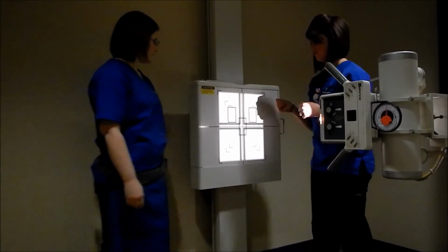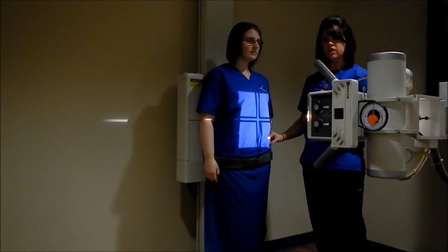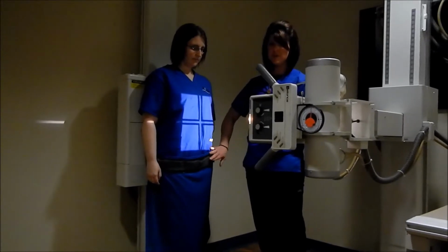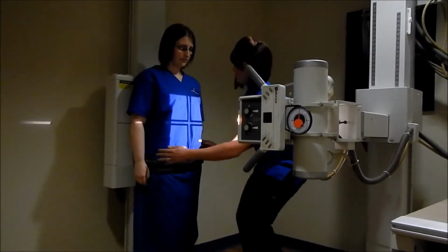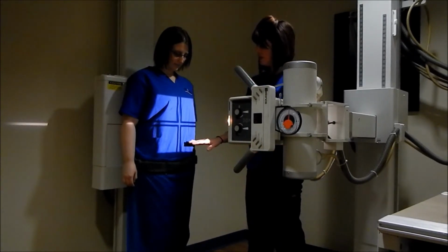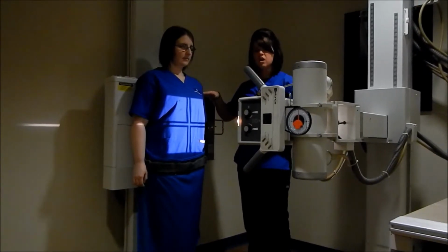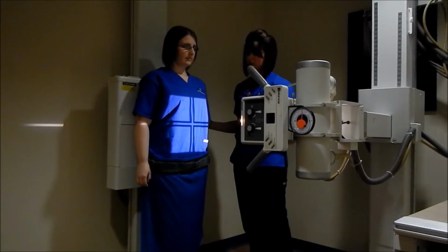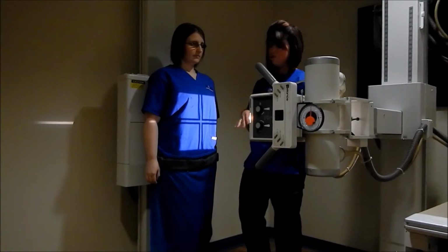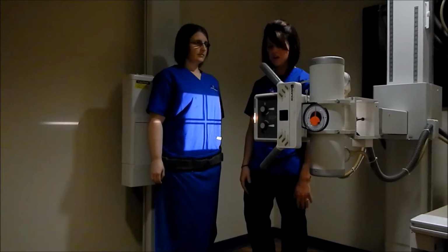I'm going to have you come on over. Now, I did put a shield on her, however, be very careful. Again, it's merely for psychological purposes, but you want to make sure you keep it out of that light. Let's have you scoot over a little bit. We're going to center again using her mid-sagittal plane. You want to make sure that your cassette is right around the armpit area. You're not as concerned this time with the symphysis pubis, so don't worry about how low you are. You're merely looking for both hemidiaphragms because you want to be able to see that free air underneath them.